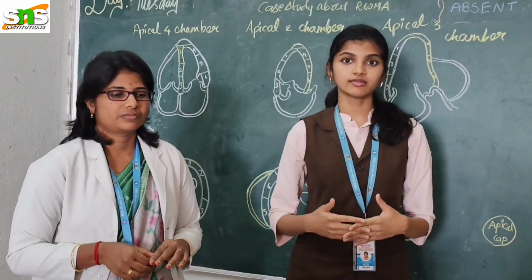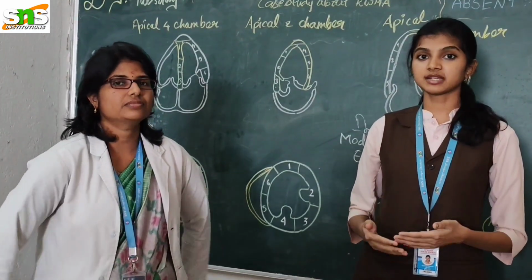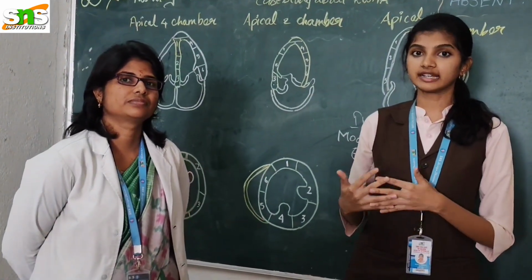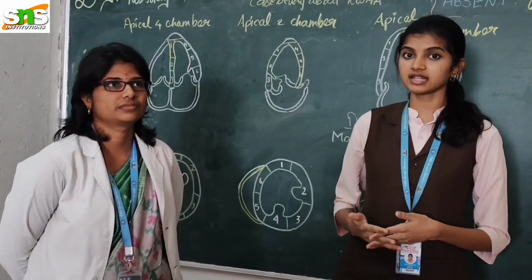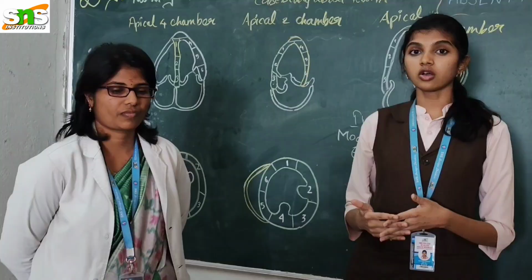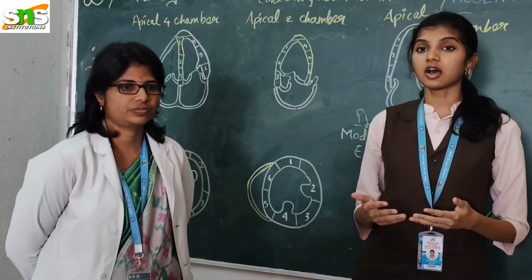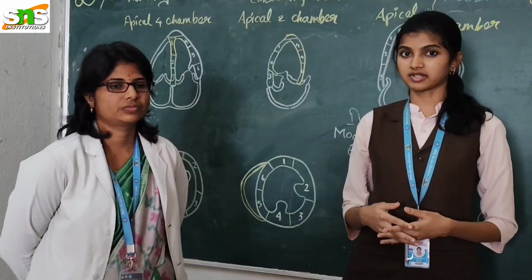For the summary, we saw this patient who is a 58-year-old male. Observing his symptoms and history, we ran a bunch of investigations and several echo assessments. Through all of that, we came to the conclusion that the person was suffering from inferolateral MI along with mild LV systolic dysfunction, also with an EF of about 40%.